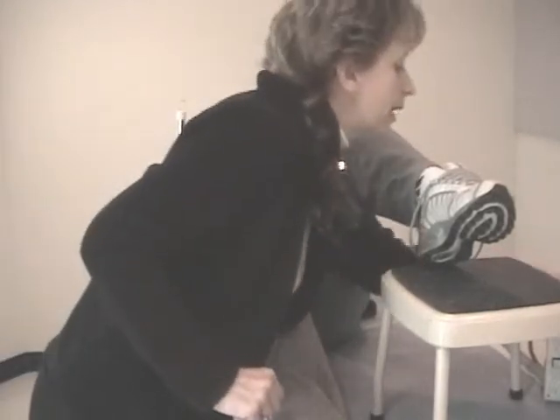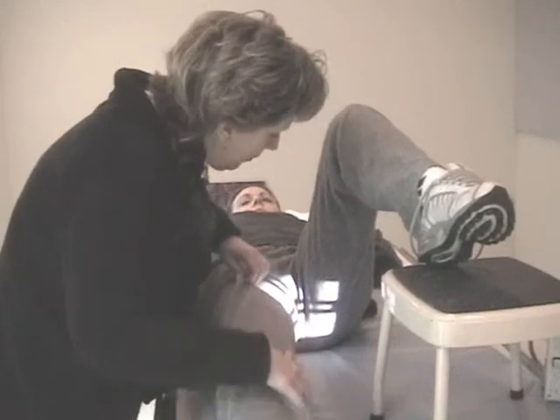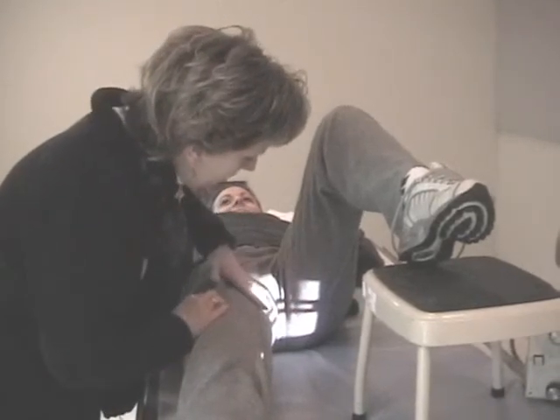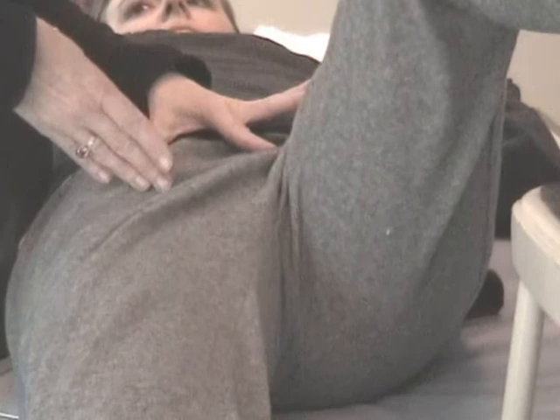Okay. Now I'm going to turn my light on, collimator light, and I think you can see here, we'll actually move the injured leg just for the purpose of demonstration, okay? You can see the crosshair coming in here, can't you? Okay. That's too low. That's not where the hip is. Here's the ASIS. There's the pubic bone. And you'll recall from the frog leg that you should be about 2 inches below that imaginary line. That's what I'm going to shoot for here. So here's my imaginary line, 2 inches below that. I want that crosshair coming right in the gluteal fold there.